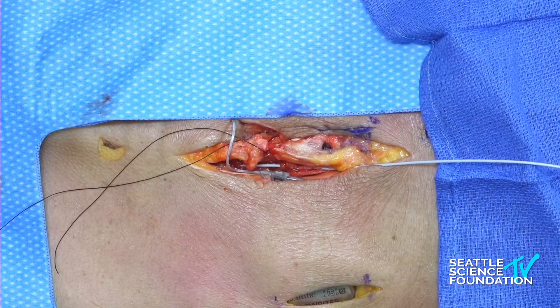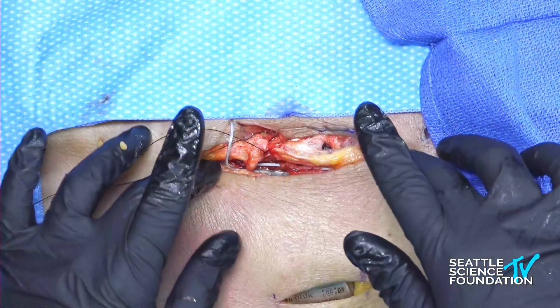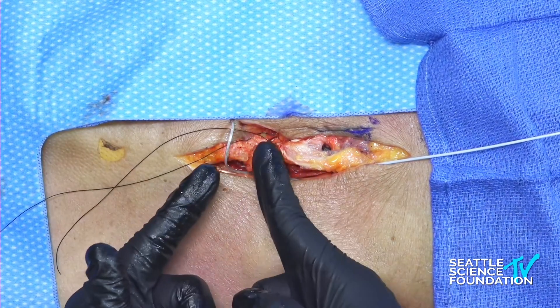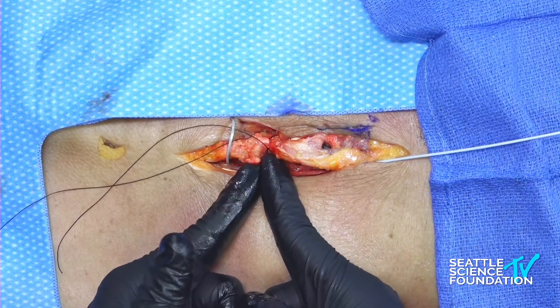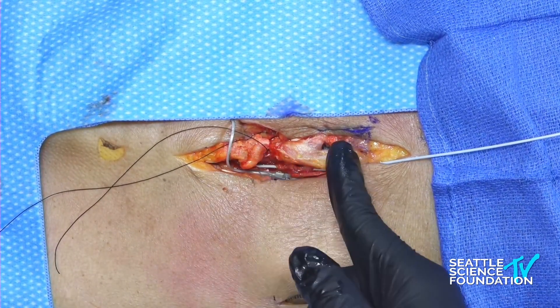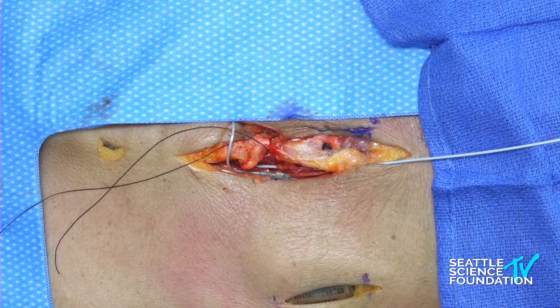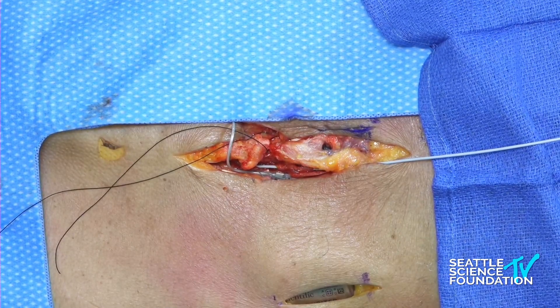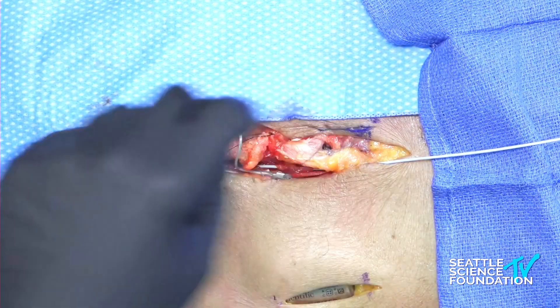That's the basis of an implant. Your incision would be about from one spinous process to the inferior portion of the spinous process to the superior portion of the next one — just enough space for the anchors to sit. Any questions from the audience or fellows on that?